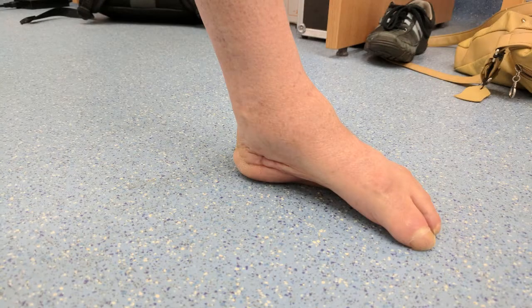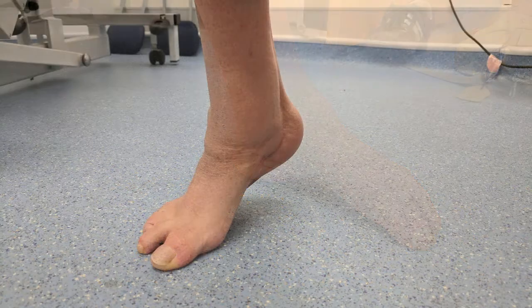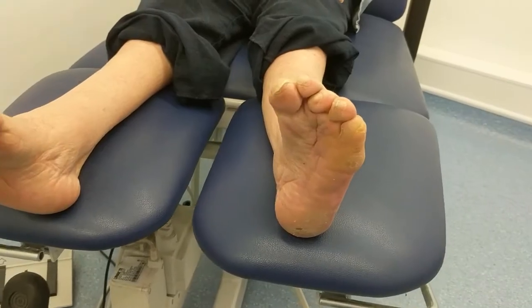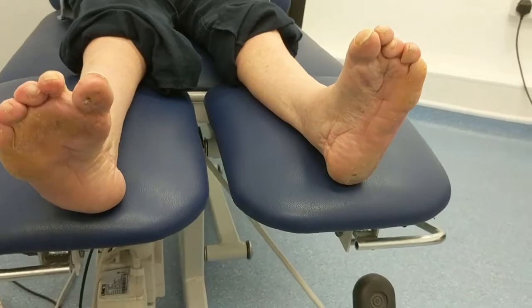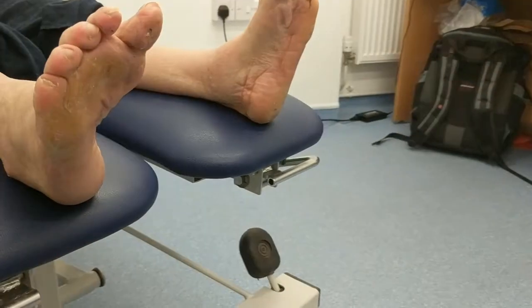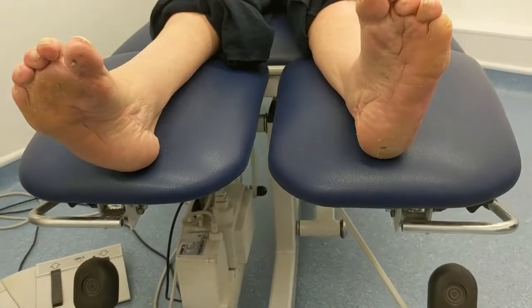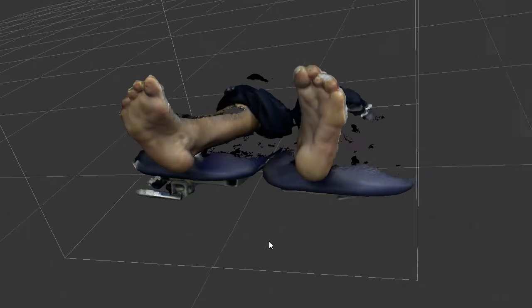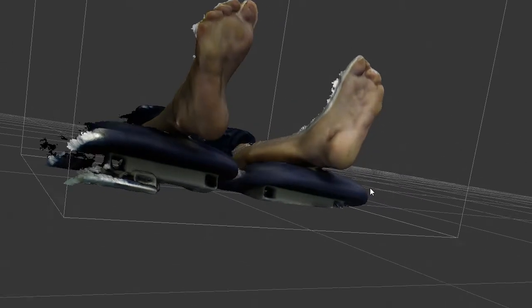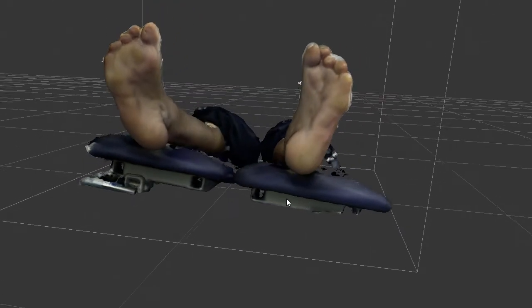On the left foot there is a significant degree of hallux plantarflexion to the extent that the first metatarsal joint is not able to achieve ground contact. On the right, the significant degree of equinus means the heel isn't even able to achieve ground contact either. This is causing the patient callosities under the fourth and fifth metatarsal areas, and also difficulties around the left hallux where the nail is contacting the ground. We took a non-weight-bearing scan of the foot and a foam cast for comparison, but given the degree of fixation and osteoarthritic change there is very little difference between the two.